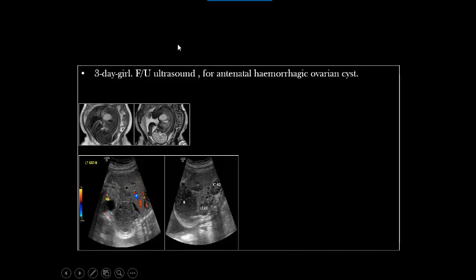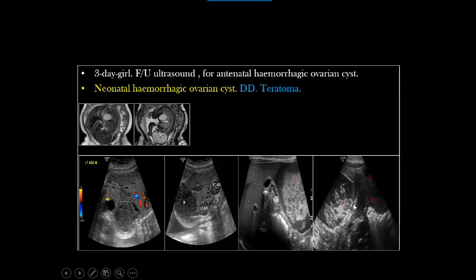in postnatal life. If torsion is suspected, do an MRI. This is another case from my practice: an antenatal referral suspecting a mass. I had to rule out renal and adrenal masses — the mass was not attached to either kidney, so not a nephroblastoma; it was below the kidney level, so not a neuroblastoma; it was on one side of the urinary bladder, most likely ovarian. No vascularity with a classic reticular fishnet lace-like pattern suggested hemorrhage, confirmed by MRI showing high T1 and high T2. On postnatal follow-up it became more complex, extending from the uterus up to the liver and gallbladder, compressing bowel and stomach posteriorly. Diagnosed as hemorrhagic ovarian cyst with high possibility of torsion.